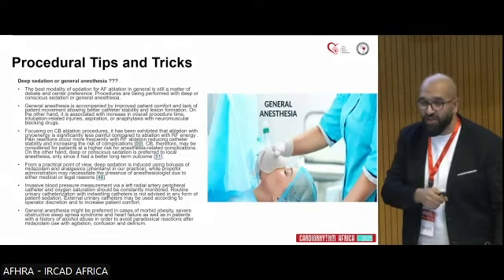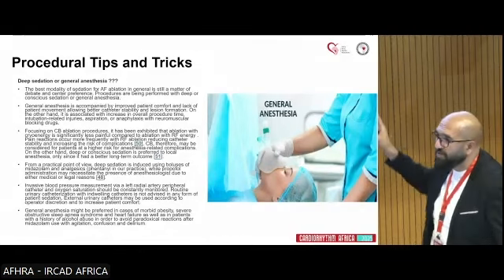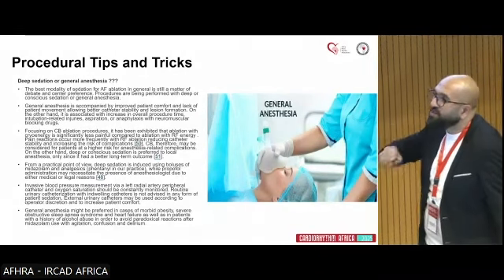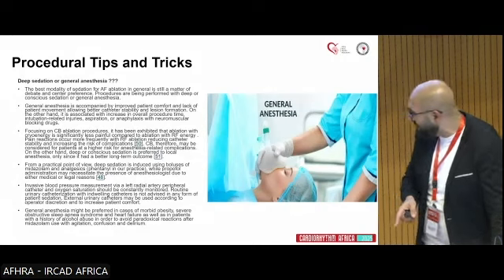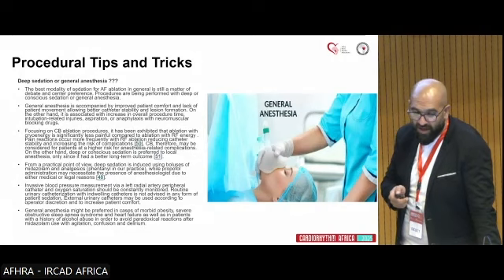As Engineer Adil told, we start with a clockwise rotation. We go for the left superior pulmonary vein, then the left inferior pulmonary vein, and that will take around 20 to 30 minutes. Then we go to the right side, where we will test the phrenic nerve, so we should avoid muscle relaxant, or the muscle relaxant effect should be released at this time.